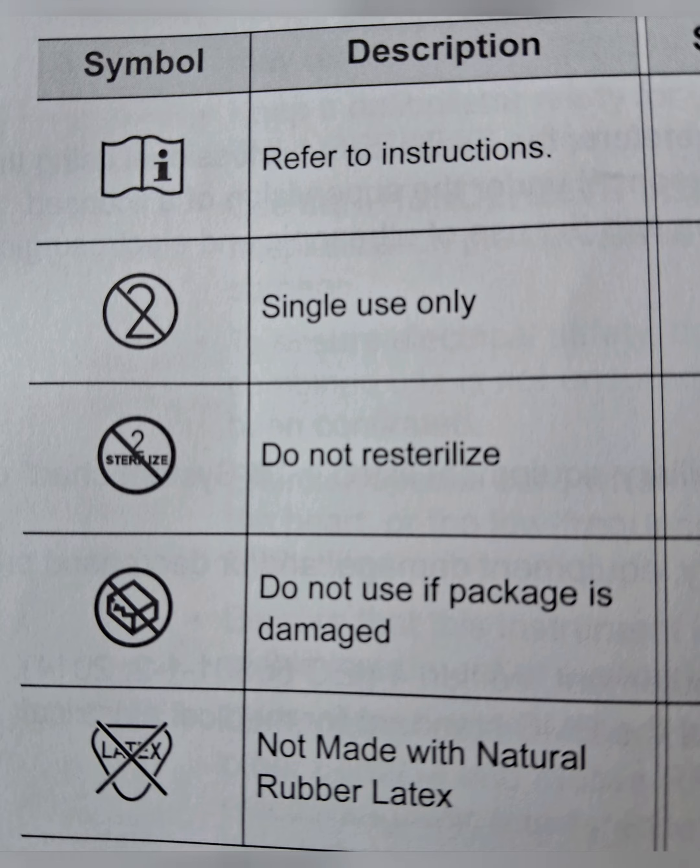There is another symbol showing '2' with a cross mark, indicating that it is for single use only and the instrument should not be used twice. There is also a circle symbol with '2' written below it, meaning do not sterilize the instrument a second time and do not reuse it.